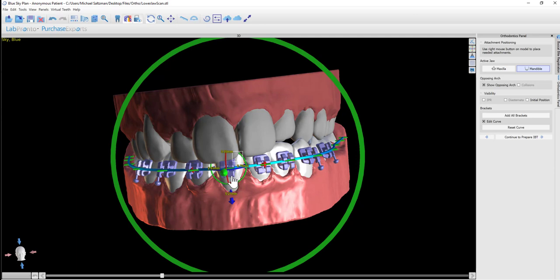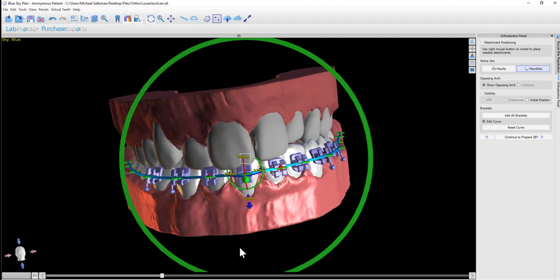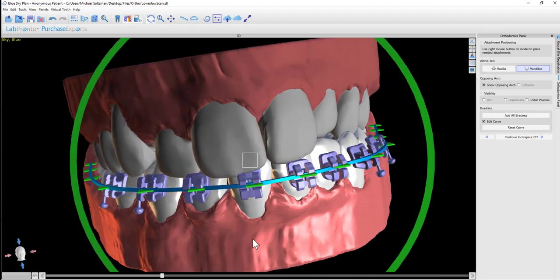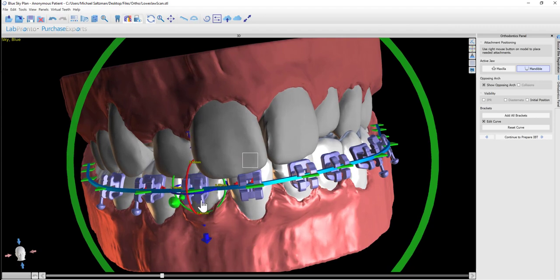You're able to put your mouse over any of the brackets and it will activate the widget. If you want to fine-tune the placement, the location, or the rotation of any particular bracket, it can be done using the widget.